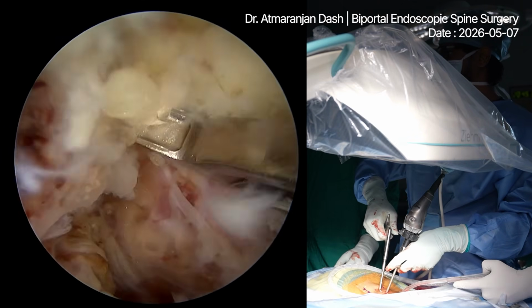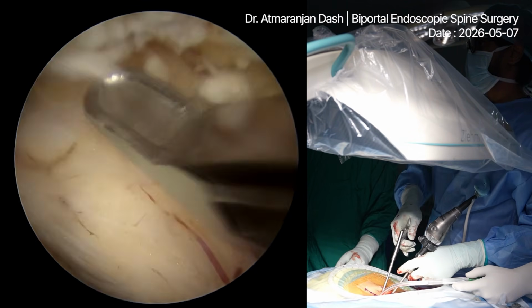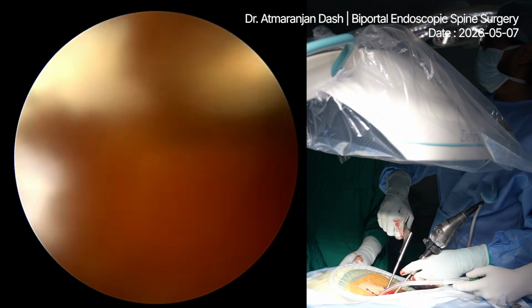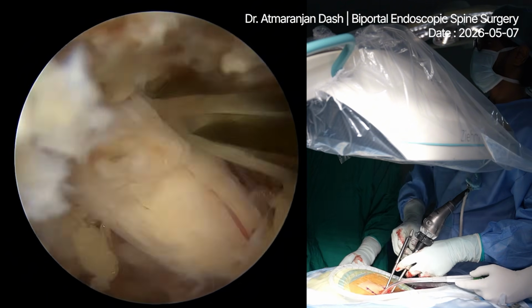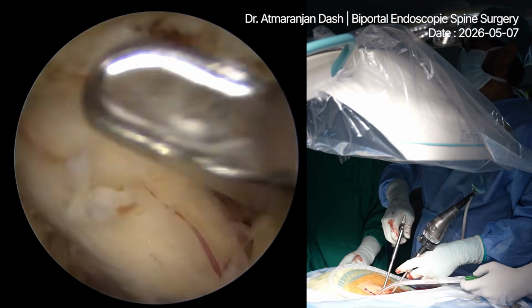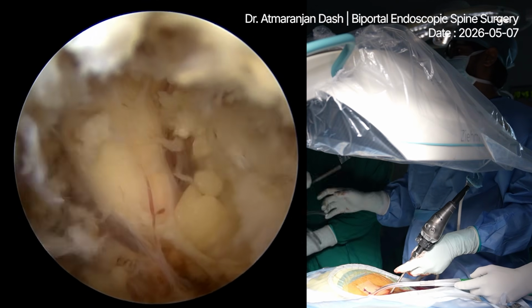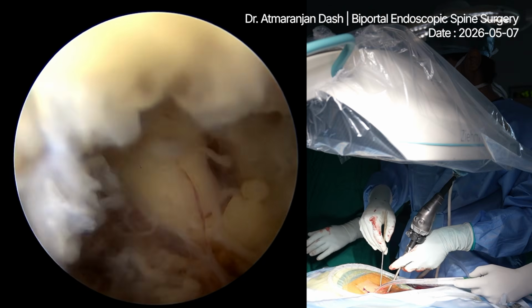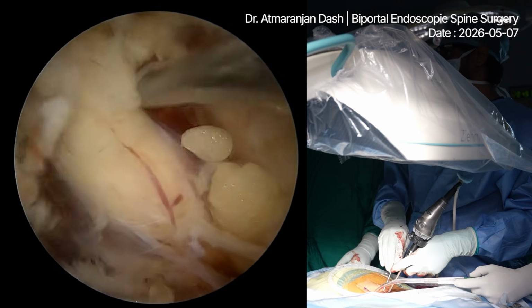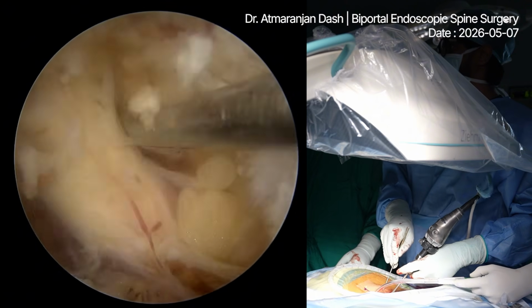So while operating this area, you have to be very careful. Sometimes you don't know what was operated last time because you are not the primary surgeon the last time. So you have to be very careful around these areas because sometimes the root will be exposed and you have to be very gentle. Bigger hook, and the job is to see whether it is going. Here it is also going, but I need to see this area.